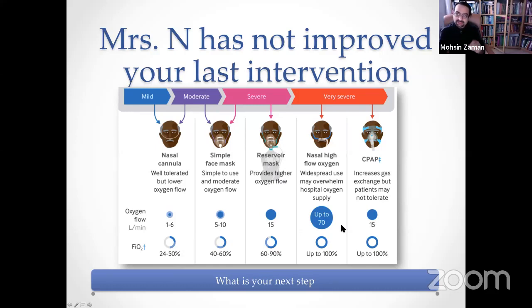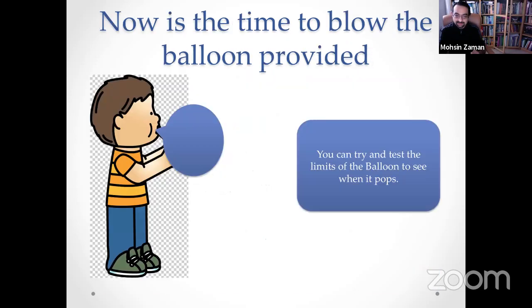who end up on nasal high flow, there have been instances, at least in the UK, where the oxygen supply has failed. So I would really shy away from using these unless you knew that you had enough oxygen and what the oxygen use was in the hospital at that time. And CPAP, of course, we will talk about a bit more in a sec.